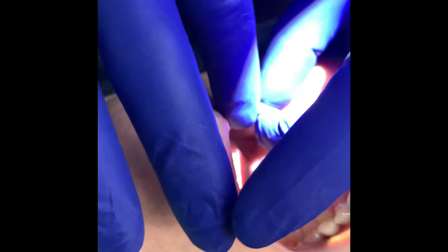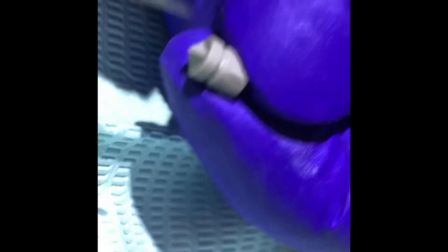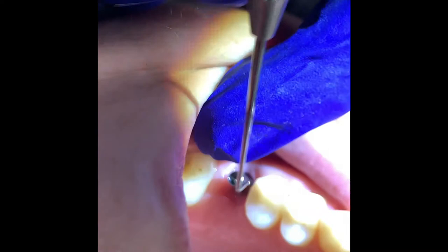Note that there's a little notch right in there — you can see that, just kind of pointing at that with my explorer. This is the scan body that we're talking about, and there's a notch right on there. We have to line that notch up with this notch right there. It doesn't matter the orientation of that notch, so I'm just going to put it right in there, then push it in, and it should clip right in. So that one's down all the way. Now we're ready to scan.